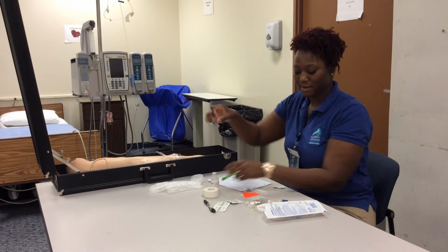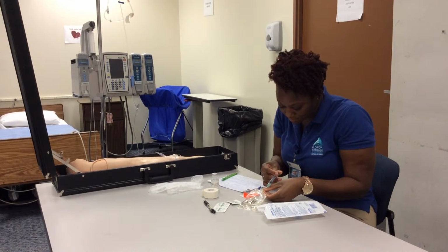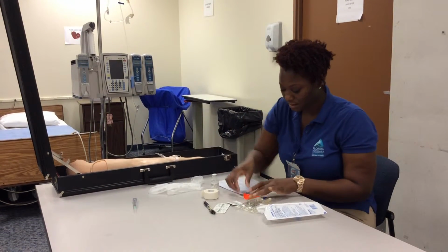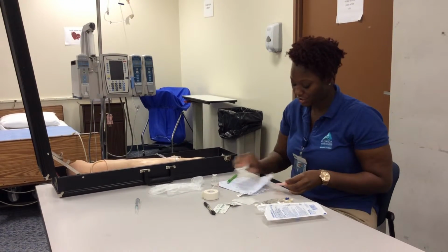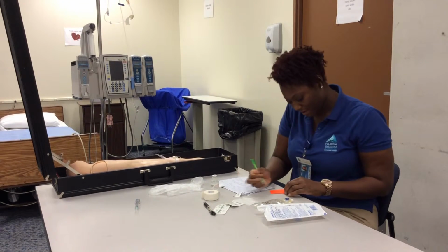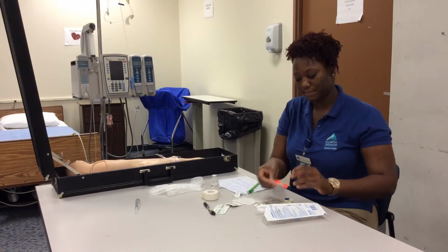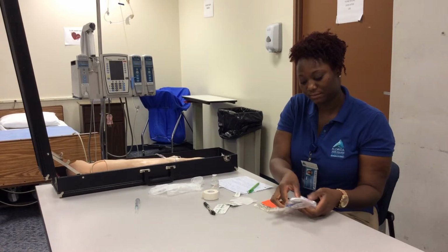Now I'm going to place it into my IV fluids, and I'm going to place this in the sharps container. I'm going to shake up my medication. Now I'm ready to label my medication. I'm going to put Phenergan, the dose, 12.5, the time, the date, and my initials. Alrighty. Place that here.